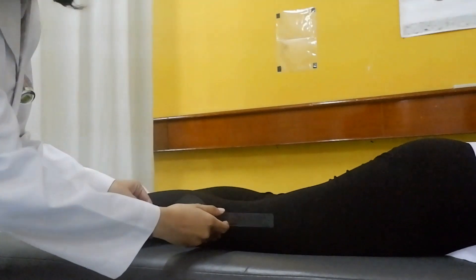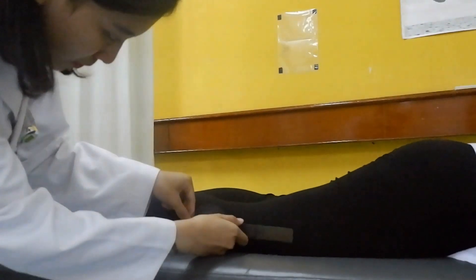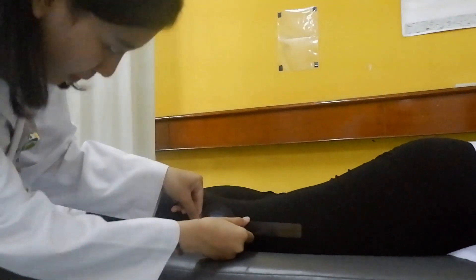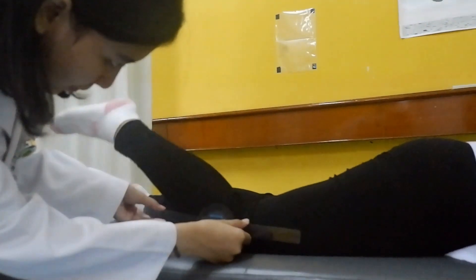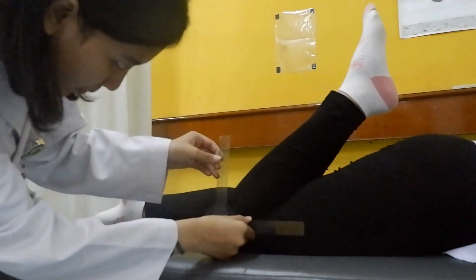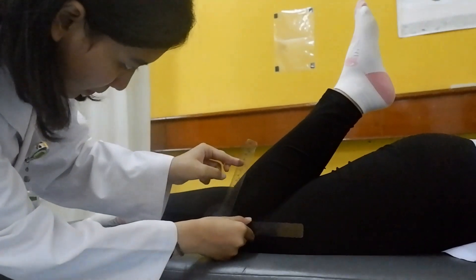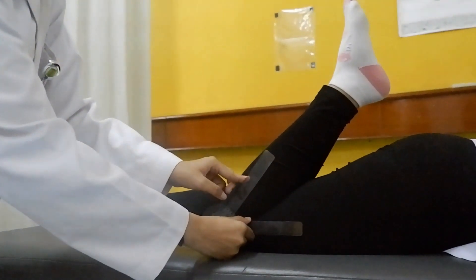Position of patient is lying prone to make it free from any restriction and to allow the maximum knee flexion. Position of the examiner is beside the lower extremity that we're testing. Using a goniometer, put the axis on the lateral condyle of femur with the stationary arm on the mid of femur and the moving arm on the mid of the leg.